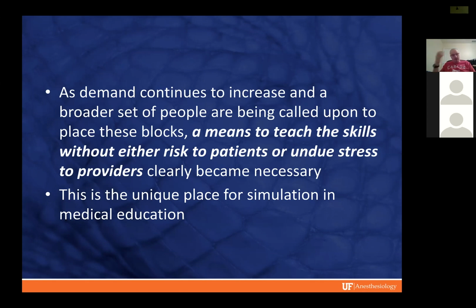And we have other simulators at our disposal that are capable of a little more, like STAN or some of the other what are called high fidelity patient simulators that are over in the sim lab. So you can go over there and you can get the machine to demonstrate a set of pathology, and you can essentially instruct the simulator that you're going to administer a treatment or a set of drugs.